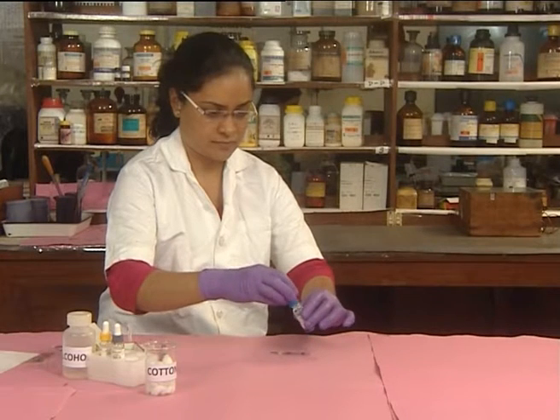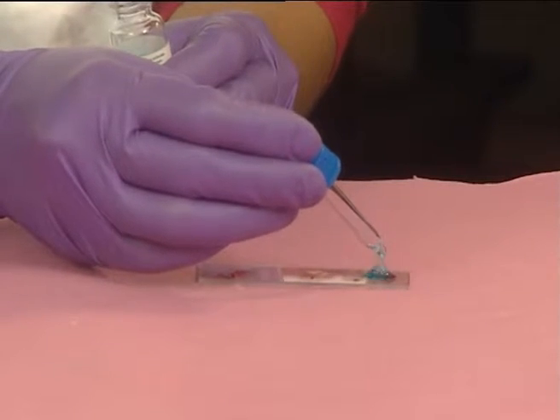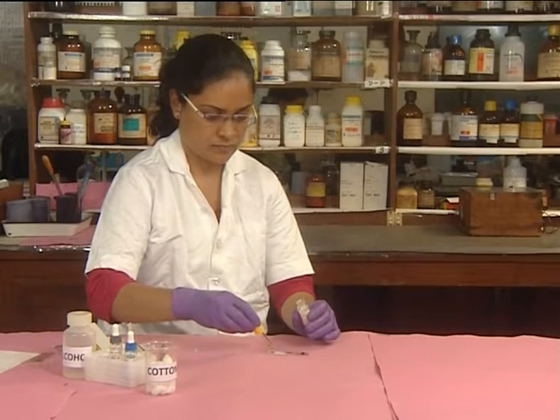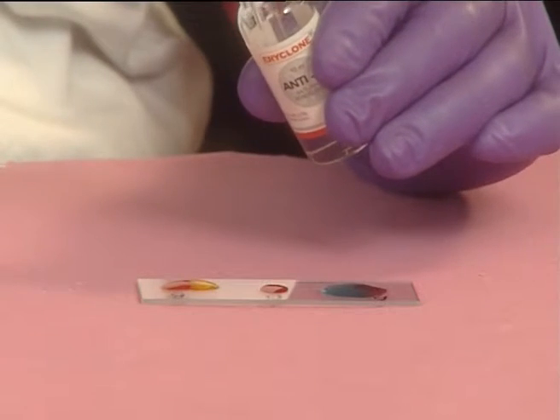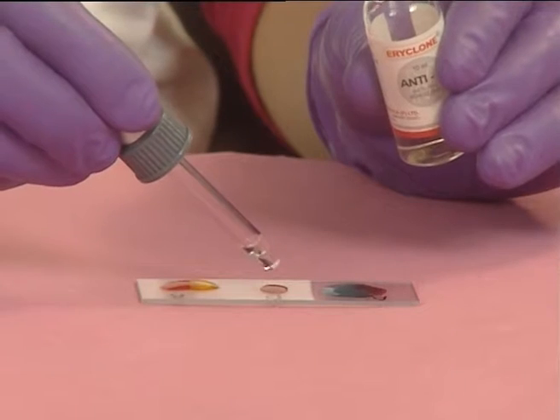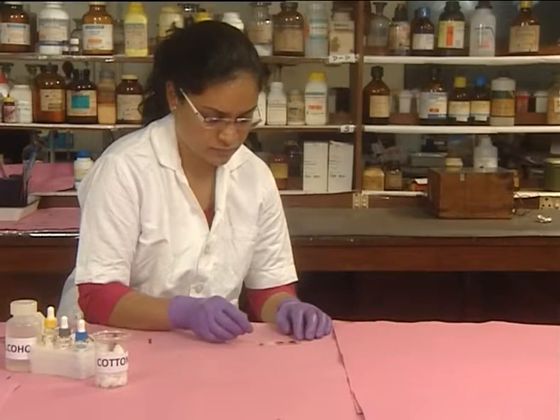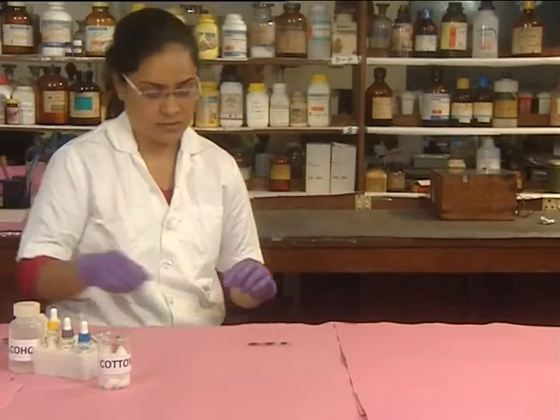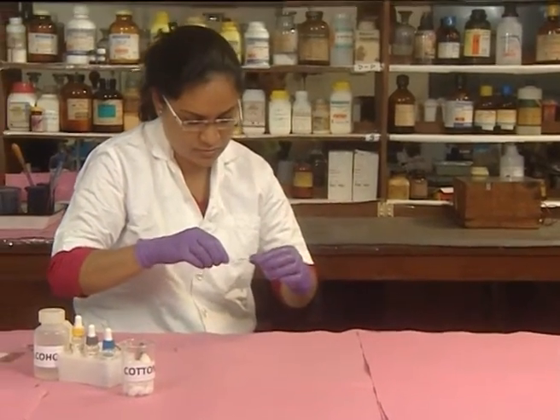Add 1 drop of anti-A serum to the A side. Add 1 drop of anti-B serum to the B side and 1 drop of anti-D to the D side. Spread each mixture over an area of about 0.75 inch in diameter. Observe the slide for any agglutination of red cells.